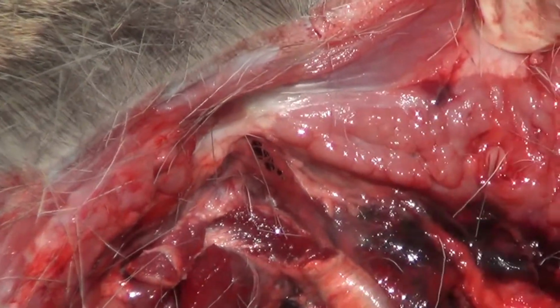So why don't we, Rachel, what I might do really quick is I'll take one of these lymph nodes out here.